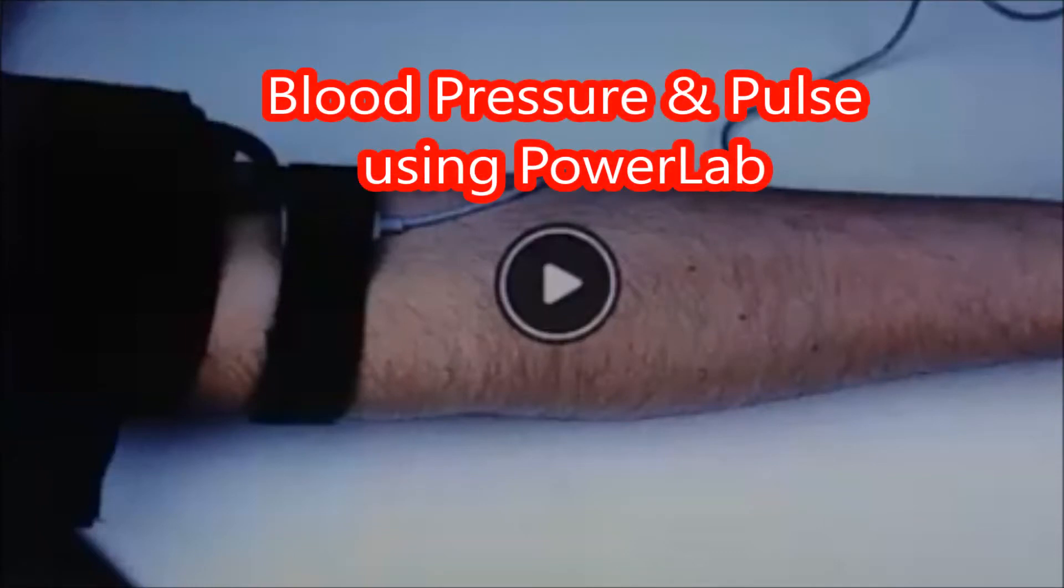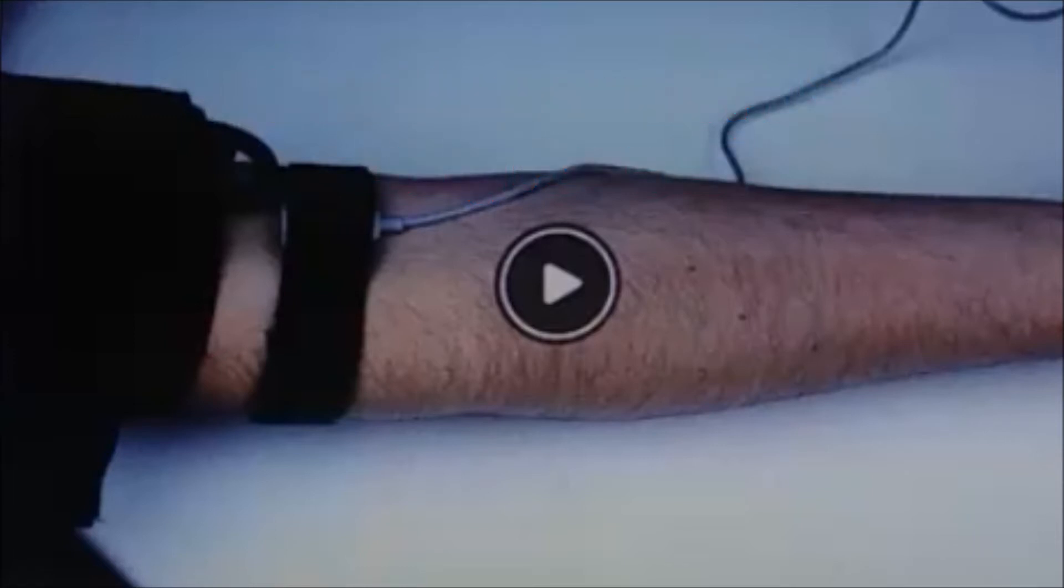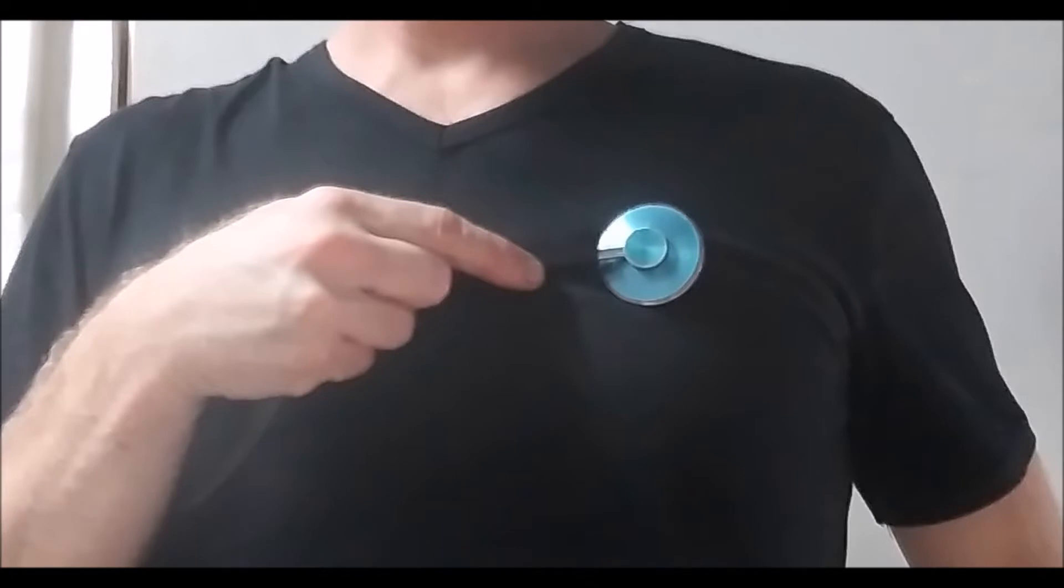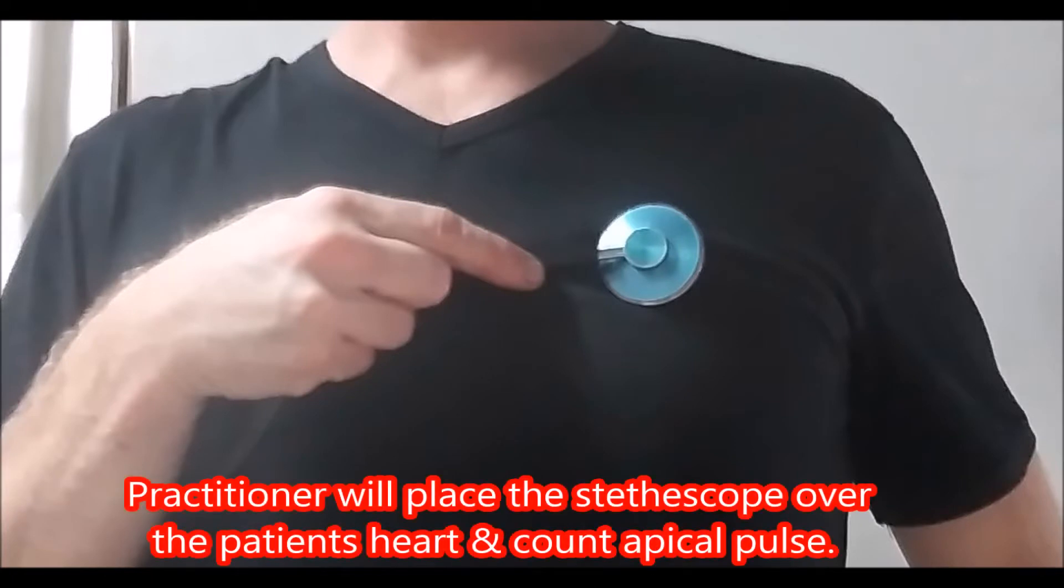Studying blood pressure and pulse using PowerLab and LT Lab Station software. First, we will be detecting the pulse deficit using manual methods.